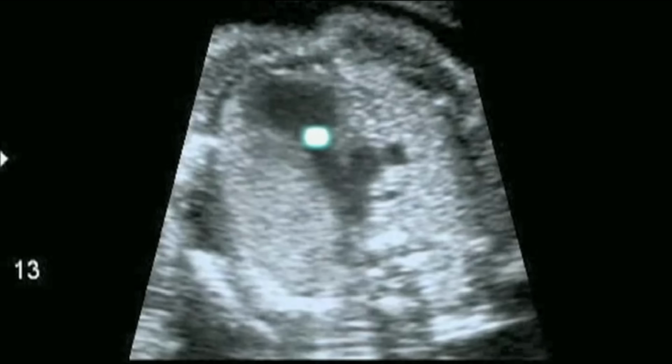Pulmonary outflow running into ductal arch. Aortic arch.